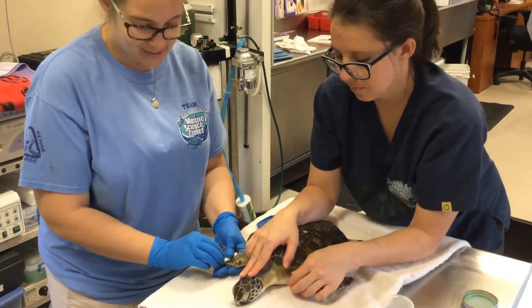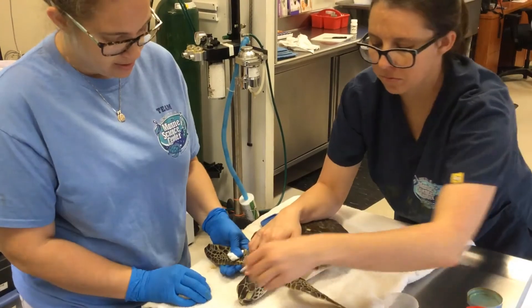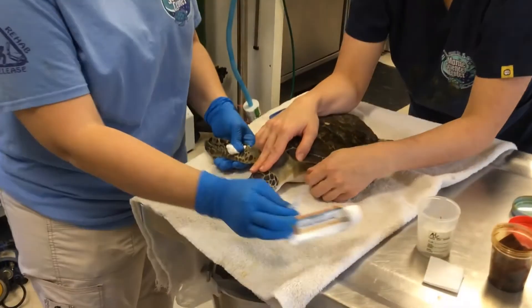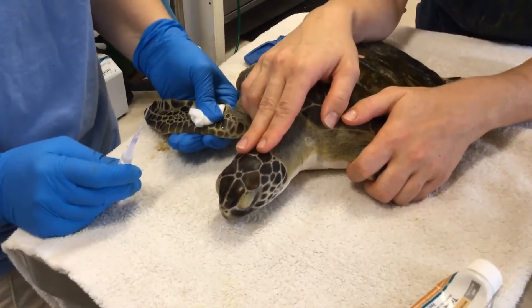I'm just going to hold that side off for just a minute, and then we'll use some tissue glue and apply a little bit of triple antibiotic over that site, because Zucco is going to be going back down into water until release.